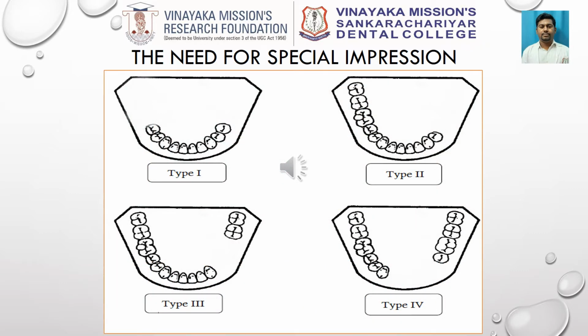Young budding dentists should understand that the journey towards a successful denture fabrication begins with making accurate impressions. A good impression will make a removable partial denture retentive, stable, and more comfortable.